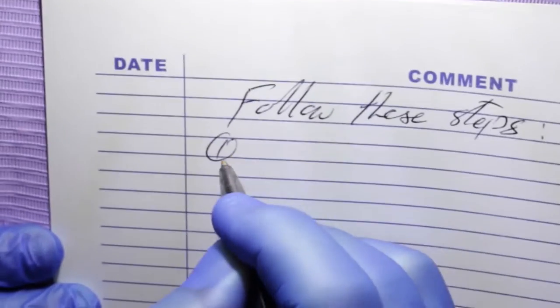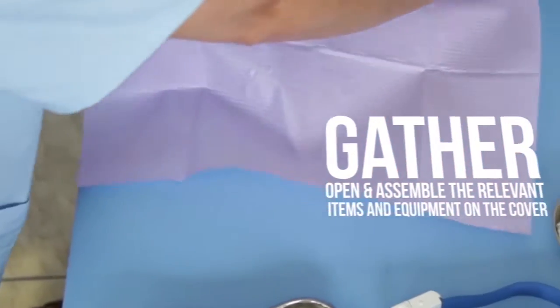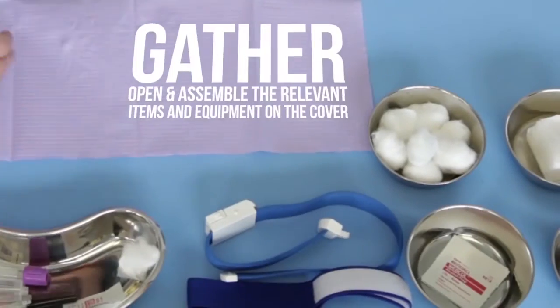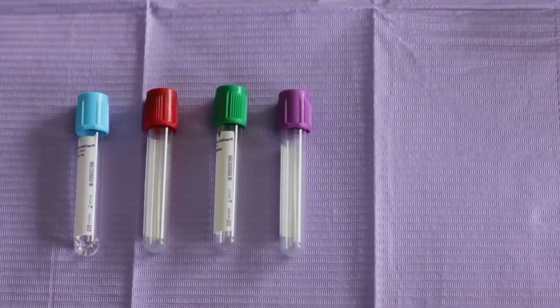Now, follow these steps. Open a clean work surface cover, then gather, open, and assemble the relevant items and equipment on the cover. Set all of the tubes you need by order of the draw.